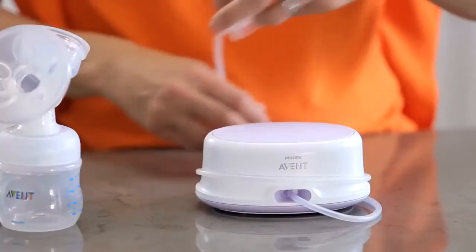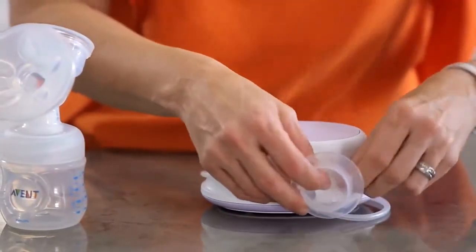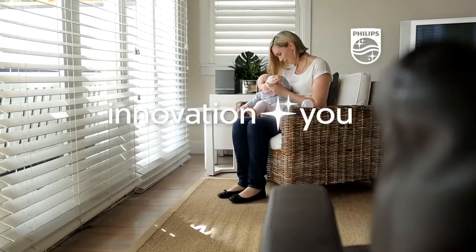Unplug the motor, and for storage you can wrap the silicone tube around the motor and clip the cap onto the tube.